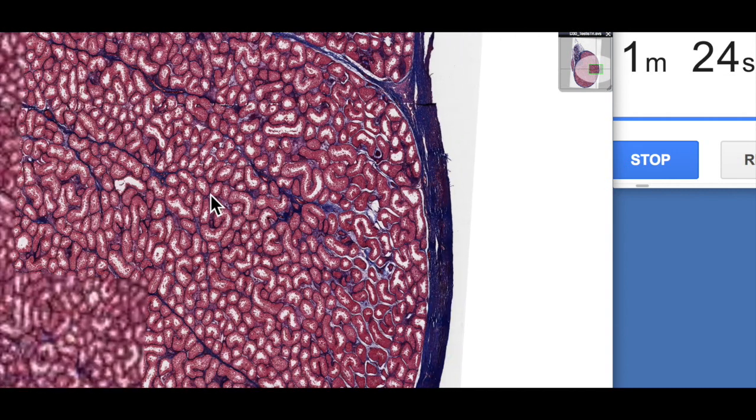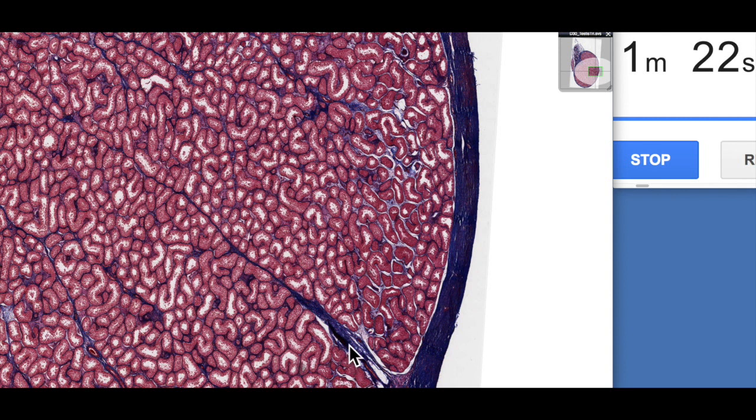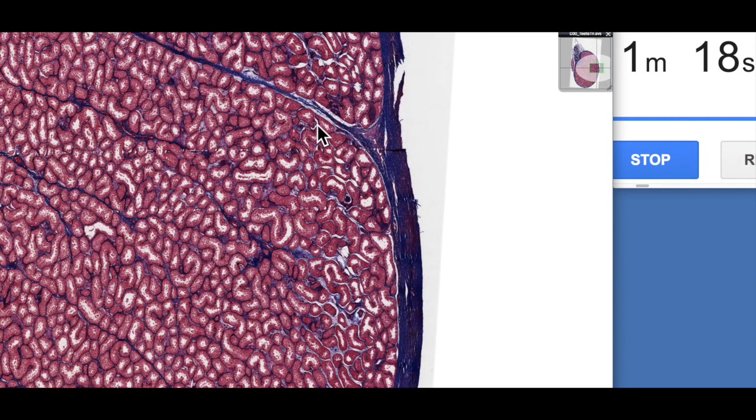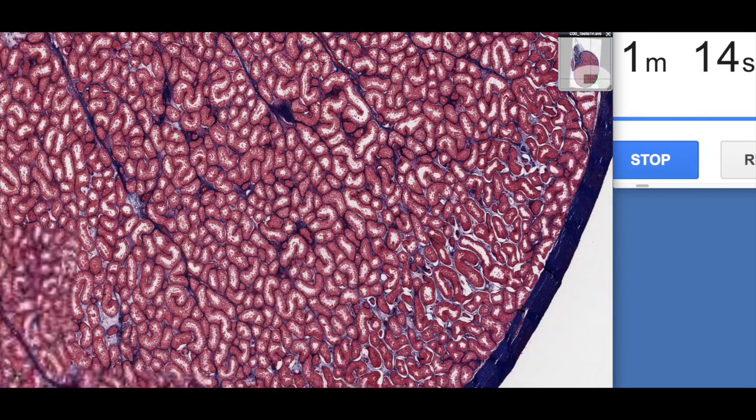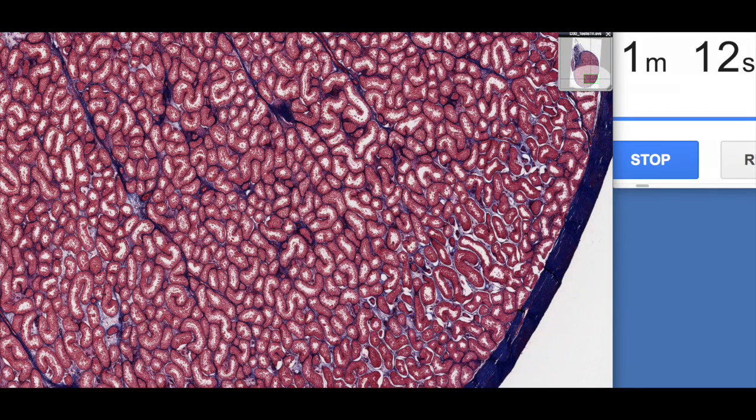If we zoom out a little bit you can see these connective tissue septa. And you can see here's one lobule, here's another lobule, here's another lobule and so on. So those are the major features of the connective tissue there.